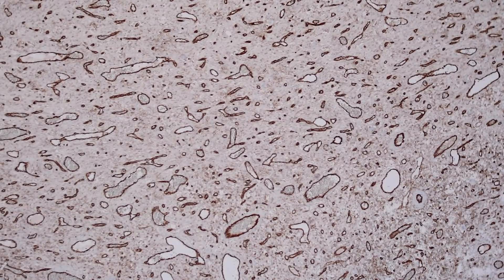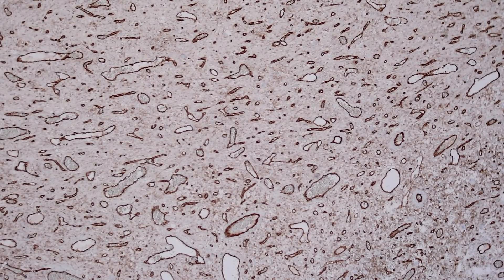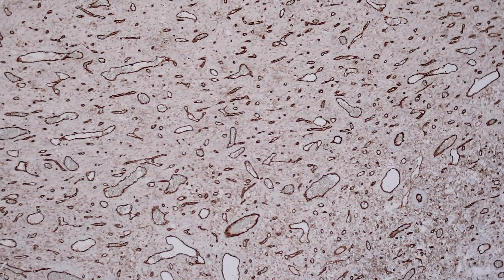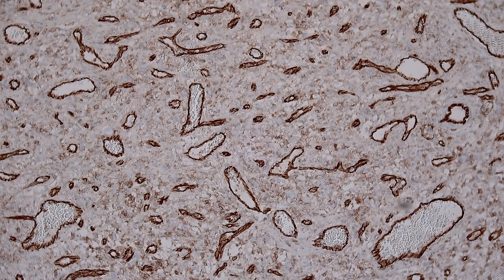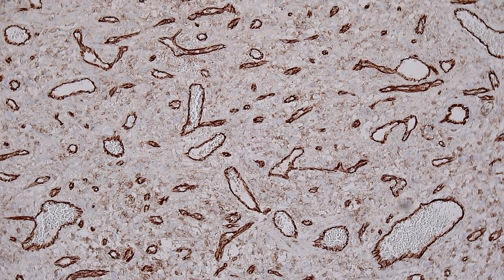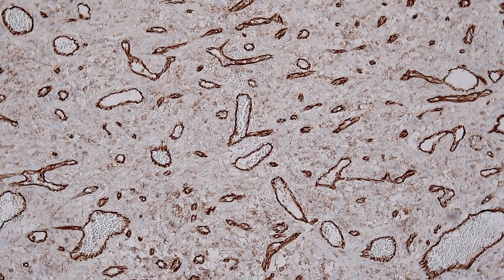I'm working on a video about vascular immunostains and vascular lesions with other stains from this case. But you can see that tumors can be highly vascularized, and in the background you can see the crisp, dark staining of the endothelial cells of the normal vessels that are feeding the tumor.